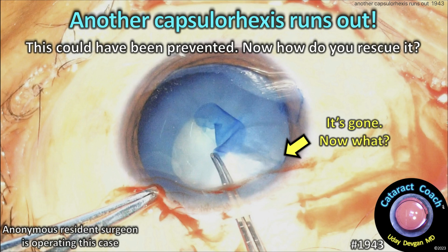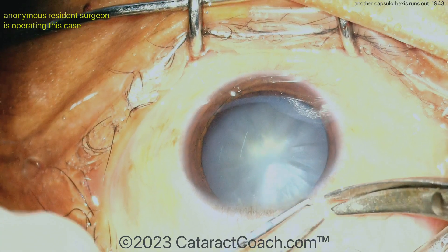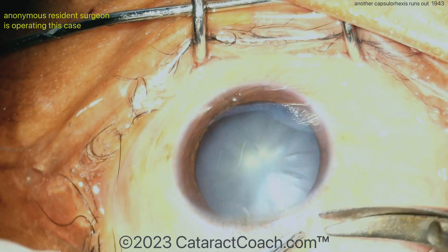CataractCoach.com. Another capsular rhexis runs out — this could have been prevented. How do you rescue it? This is a video of MSICS, Manual Small Incision Cataract Surgery.